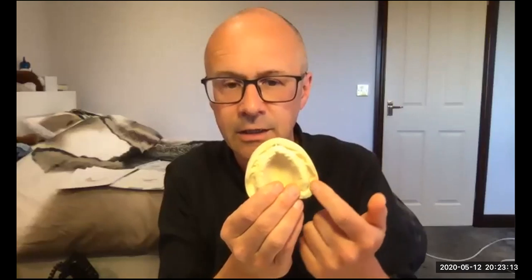Burke asks, what do you make of boxing with alginate impressions? Just like you saw with that primary impression, we don't box them. Rowan just brings the cast right the way around the impression tray, and then uses a knife just to trim it, but still preserving that very, very important land area here. So you can still get a lovely land area without boxing the impression in with wax. All it is, is just bringing it all up and over the top.